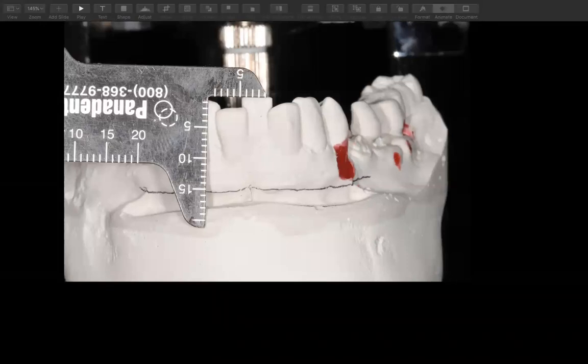So when I make these dentures for conversions, I do maybe a little tooth extractions, round off the cast. I might take it 2 millimeters below the gingival margin of the tooth, and then I make a regular denture. I know I'm going to reline it. I'm going to be building that up anyway. I just don't know how much bone they're going to take, but at least it gives me an idea.